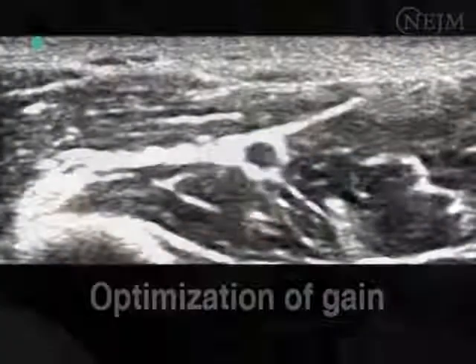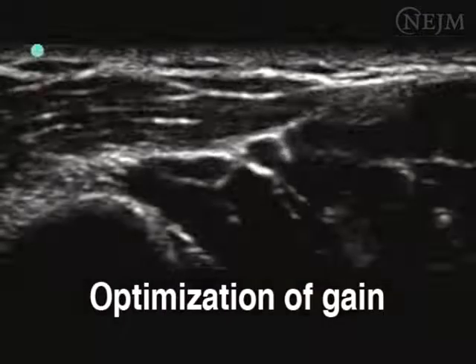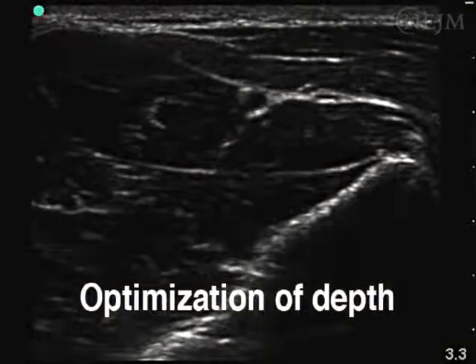Have the assistant adjust the gain and depth of the ultrasound machine so that the artery appears in the center of the screen and is clearly visible.